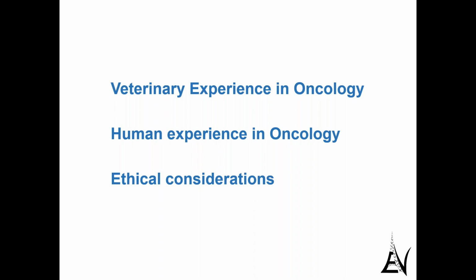radio-oncologist, radiation therapist. He's now retired for a long time. I discussed with this guy, and we ended up talking about orthovoltage, because he used to have an orthovoltage machine that he had to abandon when the cobalt machine came in. When the cobalt came in, the nuclear authority asked the radiotherapist to give a precise dosimetry on a millimeter basis, which was not possible to do with orthovoltage. It's still not possible to do dosimetry with orthovoltage like we do with LINAC.